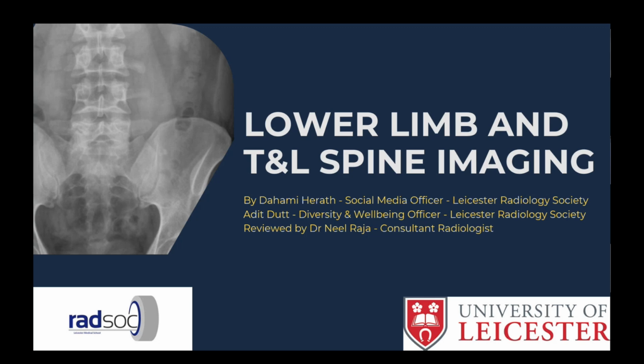Okay. Today, I'm going to go through some quick how to interpret MSK imaging, and then we're going to go through some cases of different presentations. There'll be some references and a little summary at the end.